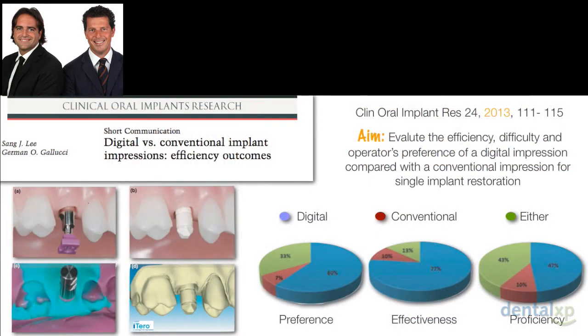Before starting our cases overview, I just want to cite one of the few articles present in the literature, from Dr. Gallucci, where he compared digital versus conventional implant impressions. The aim of his study was to evaluate the efficiency, the difficulty, and the operators' preferences of a digital impression compared with a conventional impression for single implant restoration.